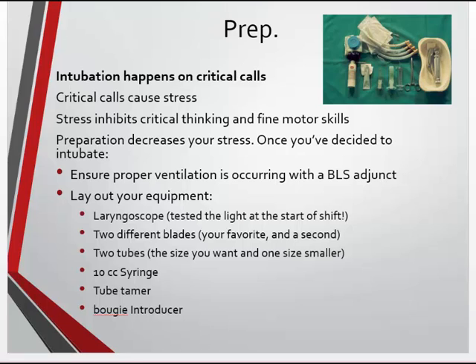So once you've decided to intubate, you want to do these things. First of all, you want to ensure that proper ventilation is occurring with your BLS adjunct. Ideally, you're going to have fire or your partner there who's going to be helping you do these things. And remember, as the medic in charge of the call, it's your job to make sure that's happening properly as well. So you should be scoping them out, making sure that they're not hyperventilating patients and that they're doing things properly. You're getting good seal, you're getting good chest rise.